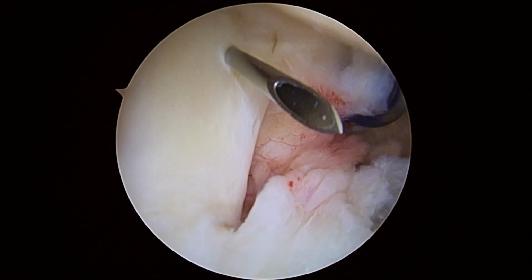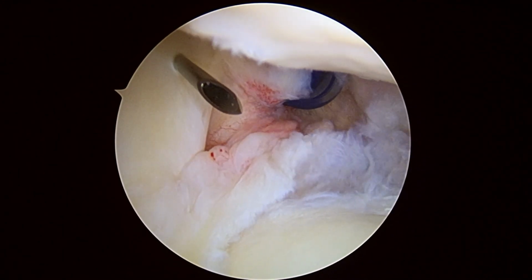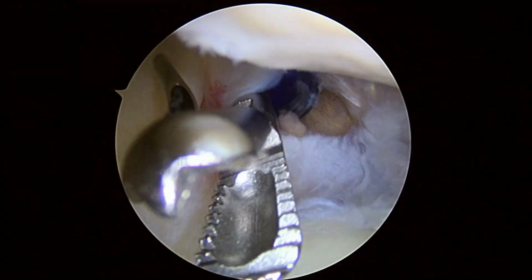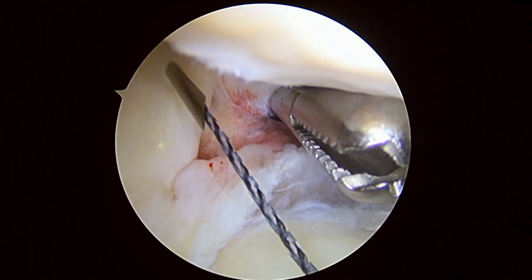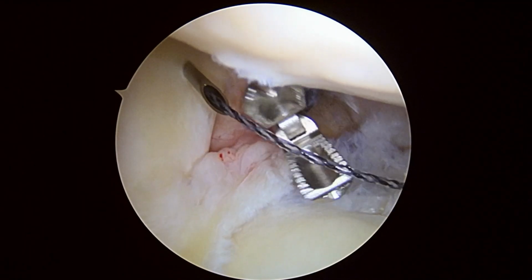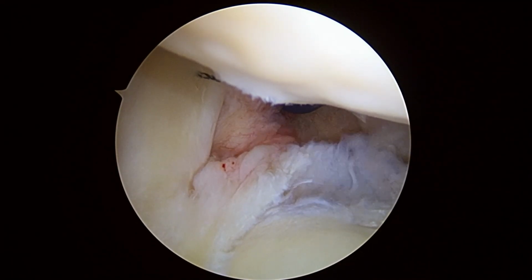We'll take a grasper. So there's the relay coming through. We'll take a grasper and grab the relay. This is what allows me to move suture back and forth. And we'll just feed a bunch of that in. Okay, so now we back the needle out. We'll go ahead and load that relay with a suture.